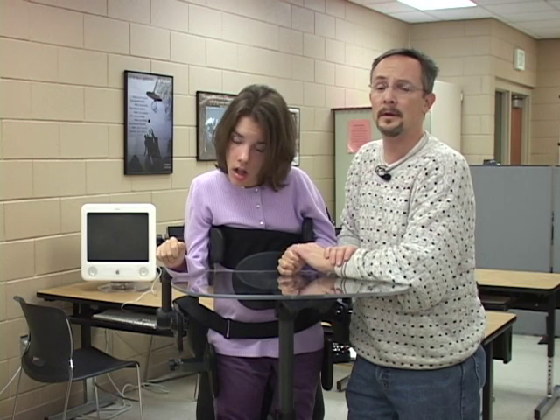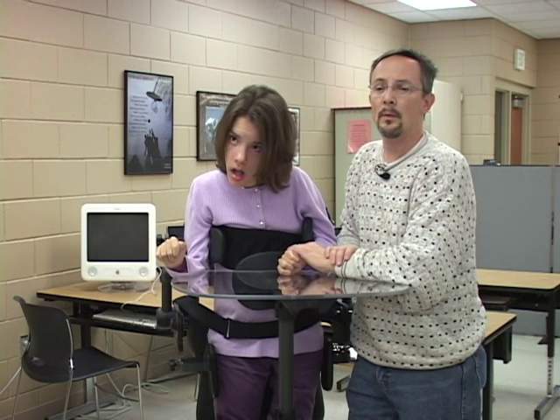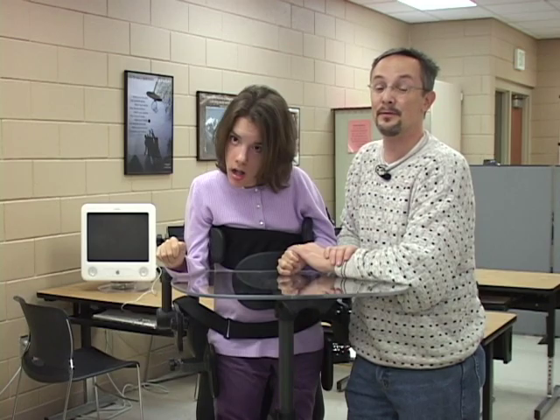The first time we ever did anything with standing was in preschool. They had a Rifton stander at that time, and it was a supine stander that they put her in, and that's what they did at school, and we didn't have anything at home. Once we got out of preschool, they didn't do much at school, so then we pursued our own standing through the therapists at Gillette Hospital, and they did an evaluation, and we determined that a stander where we could actually get her up was easier than putting her in a supine stander because that was too much work for us.